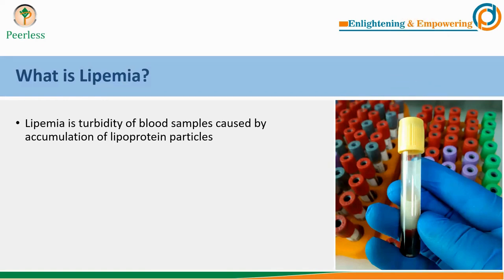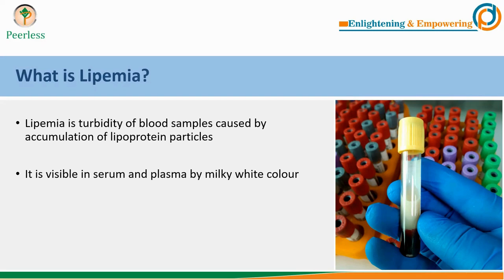To begin with, let us see what is lipemia. Lipemia is turbidity of blood samples caused by accumulation of lipoprotein particles. After centrifugation, if the plasma or serum color is milky white, we call it a lipemic sample. Please note that you cannot visually detect lipemia in whole blood, naturally because blood is red.